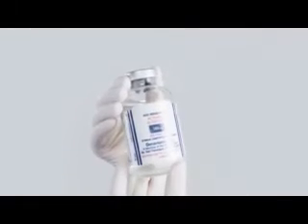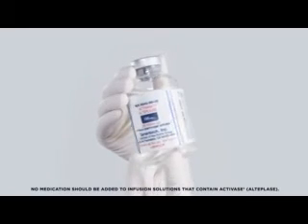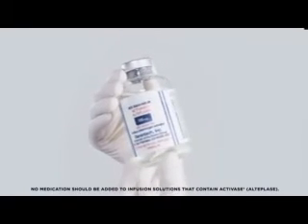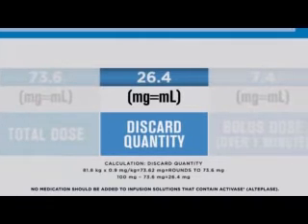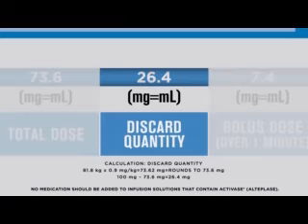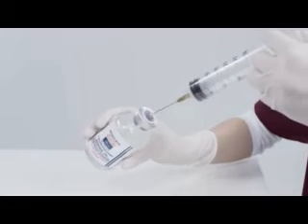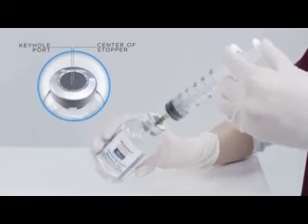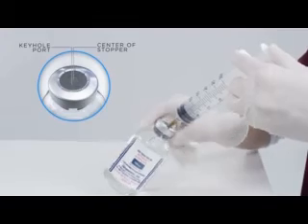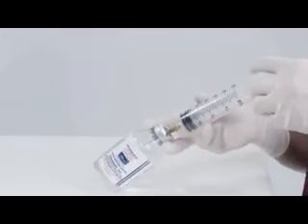Visually inspect the Activase solution for particulate matter and discoloration before administration. To ensure proper dosing, discard excess by removing the excess drug from the Activase vial. To remove the discard quantity of 26.4 milliliters, slightly tilt the vial and insert the needle into the keyhole port of the vial top, away from the puncture site made by the transfer device.